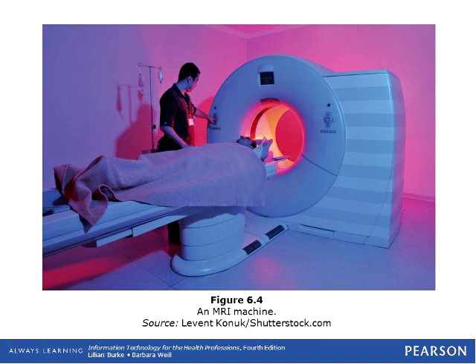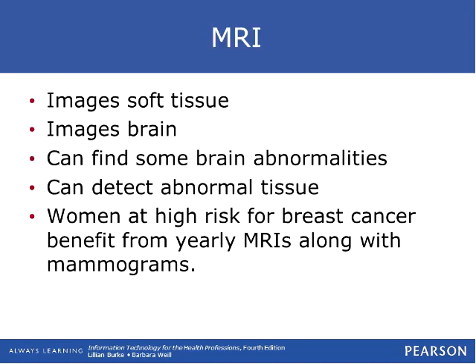People that have trouble with weight, obesity, can then get in and out of that. Or if they have claustrophobia, they can see they're not totally surrounded by this machine. Now, the good news is it does super imaging. The bad news is it's noisy as heck because you hear the banging of the mechanics of it, and so it can kind of drive you crazy.